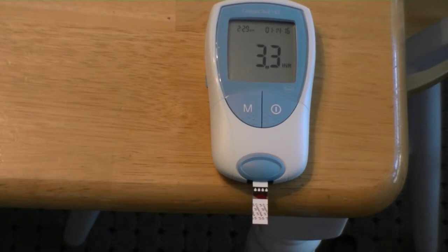3.3. For some people that would be considered high. My doctor wants to keep me between 2.5 and 3.5, so for me that's absolutely perfect. In fact, they prefer that I'm a little on the higher end rather than the lower end.